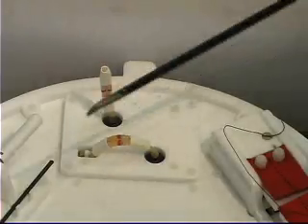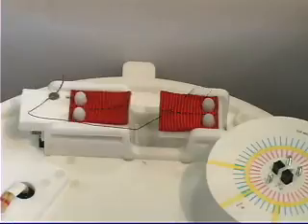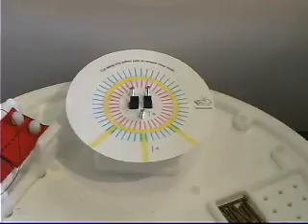The eighth task involves an extracorporeal knot around the horizontal tube. The ninth task is an intracorporeal knot, the integrity of which is verified by a built-in tensometer. The final task is to cut a circle delineated by a yellow line as shown here.